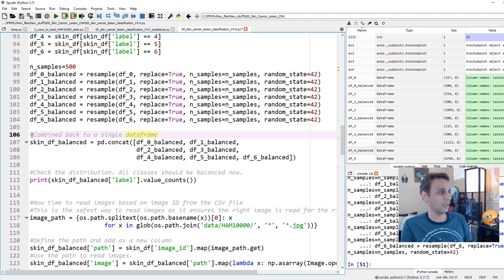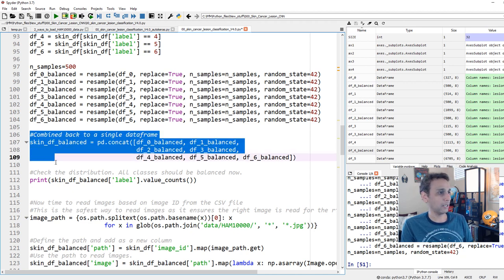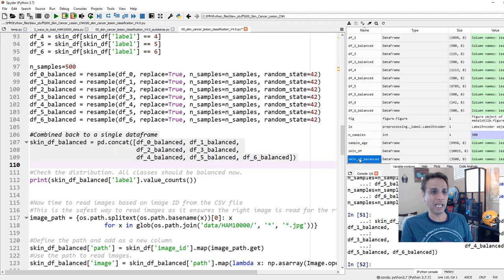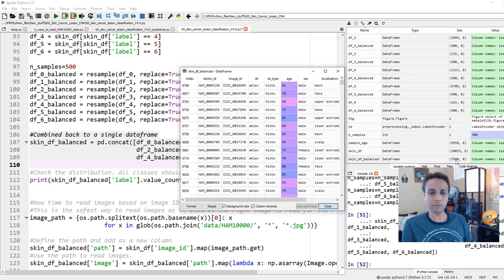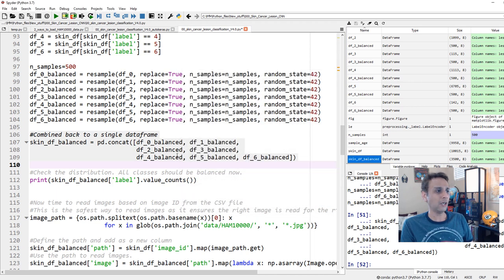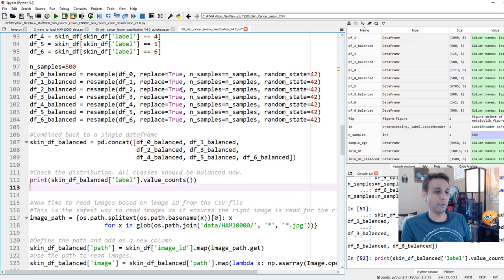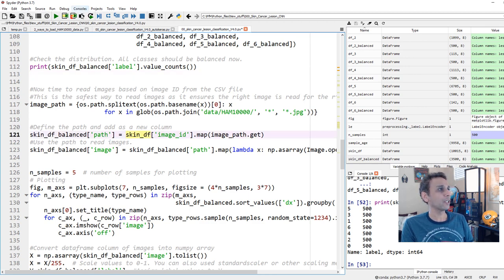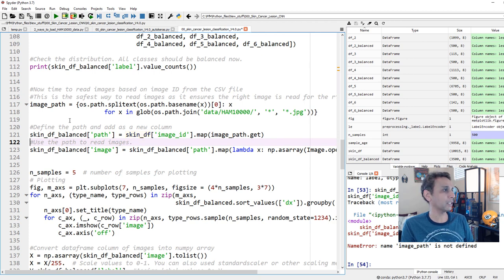If you look at skinDF_balanced, you'll see 3,500 data points total — 500 times 7 classes — with all original columns. Now let's verify each class has exactly 500. This is how I chose to balance; if you have a better approach, leave it in the comments. Now I'm going to run the next lines — but first, the image path isn't defined yet, so let's run that line too.